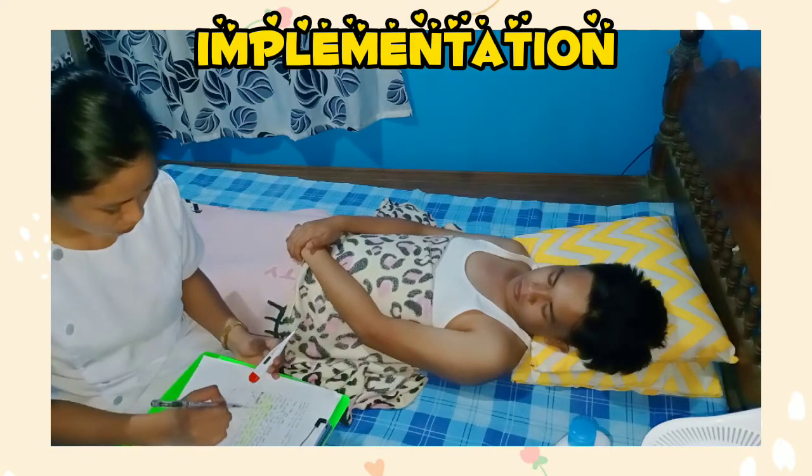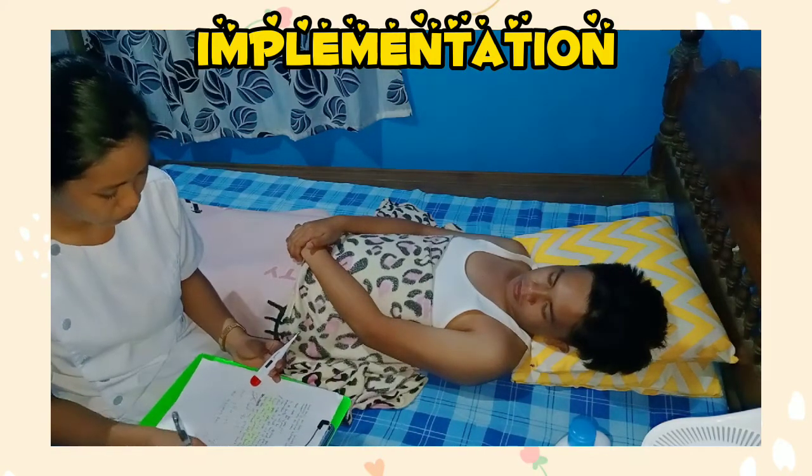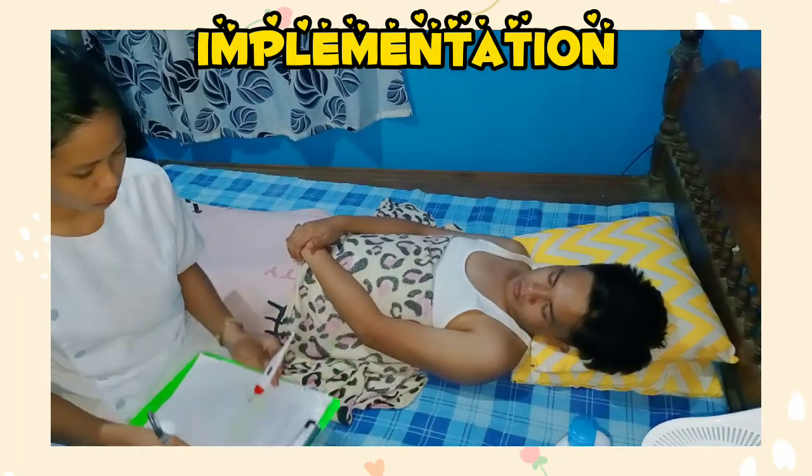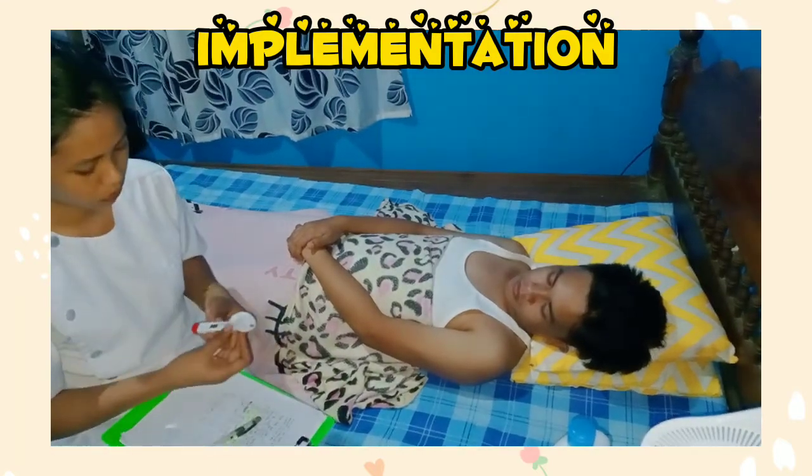If the temperature is absolutely too high, too low, or inconsistent with the current condition, we check it with a thermometer known to be functioning properly.